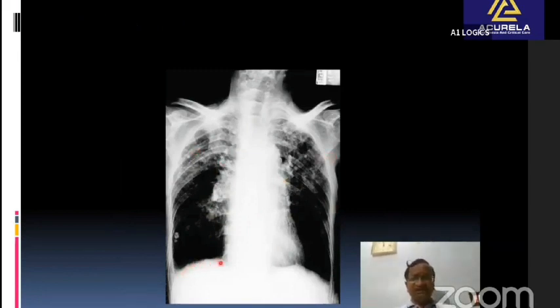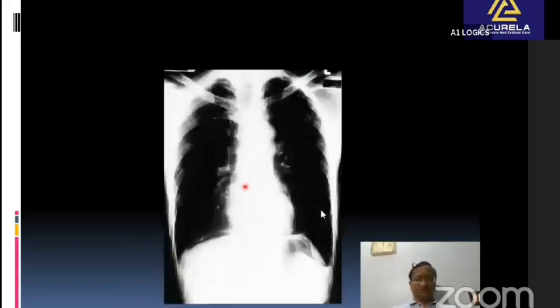Here you can see the diaphragm is not very regular. The contour is not bulged like this. All these things possibly, maybe here you can see this is a case of silicosis. If you miss like this, you are obviously likely to miss the perforation. So directly avoiding pneumothorax and things like this, directly seeing the lung shadows, you are likely to miss the perforation.